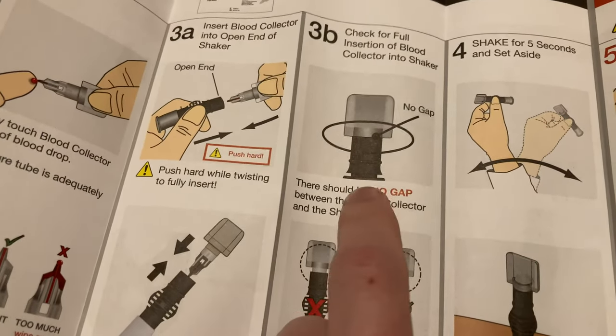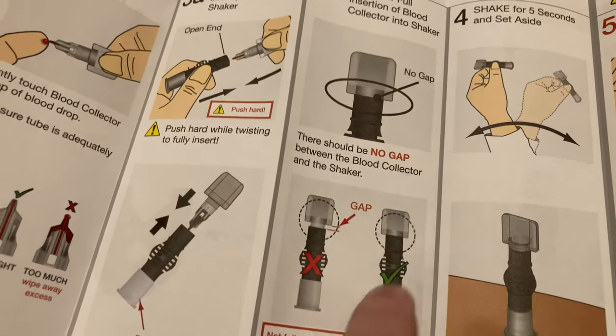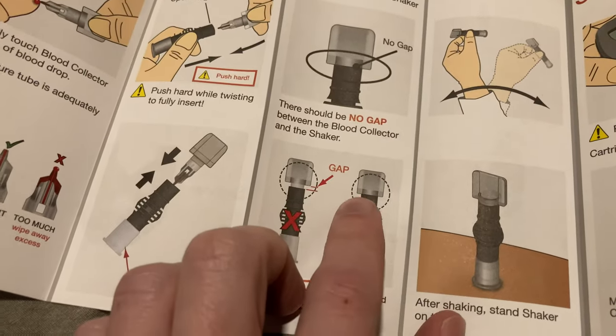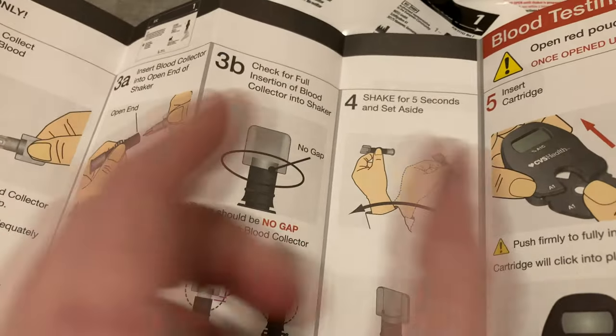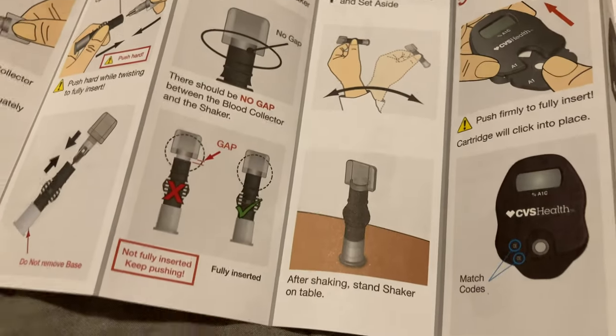And it has to be airtight. So you don't want a gap like this. It has to be snug like that. And they see, not fully inserted. Keep pushing if it looks like that. Fully inserted means it's sealed. All right. Now you're going to shake it once you've completely sealed the tube. You're going to shake it back and forth for 5 seconds and set it aside.